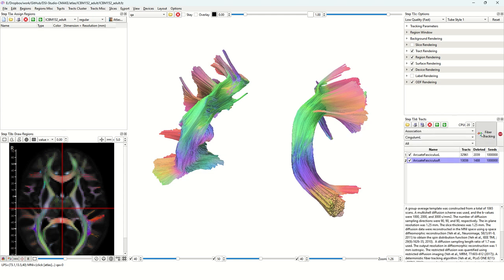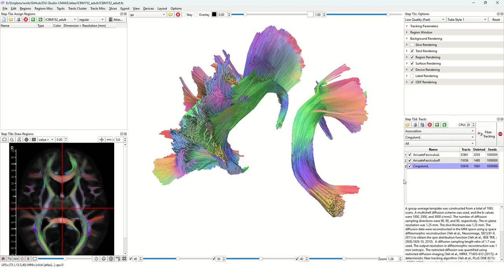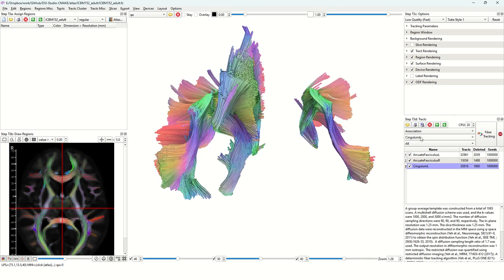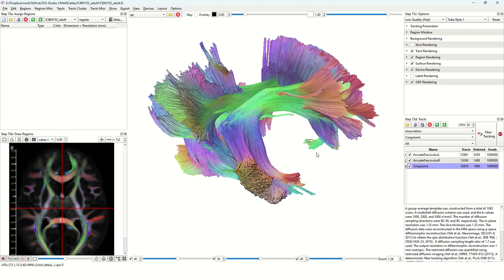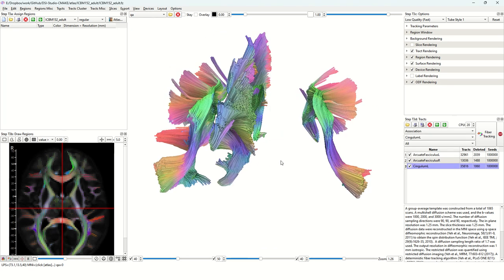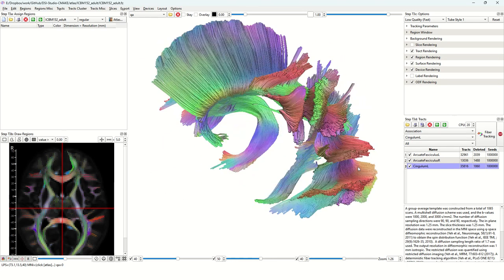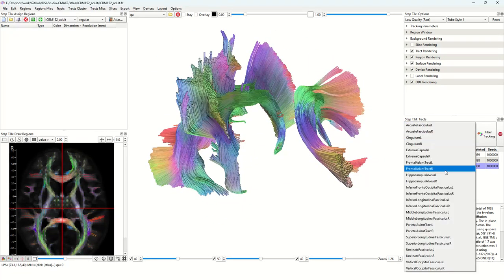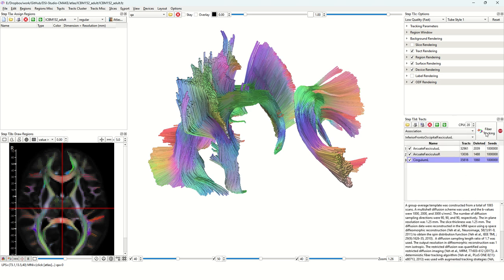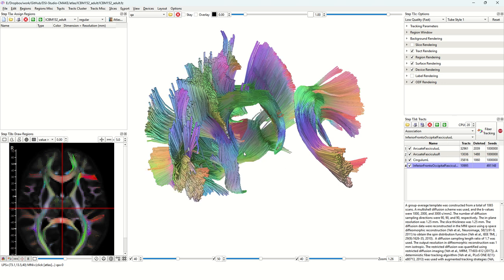Here we quickly map the left and right side arcuate fasciculus. I can add more like the cingulum or a list of tracks of interest. I would recommend some major tracks under the association pathway, as they always have large individual variation that could be correlated to cognitive function or some critical functions. For most studies, you'll consider major tracks under the list of association pathways, for example the cingulum and the inferior frontal-occipital fasciculus. First, we get these tracks.